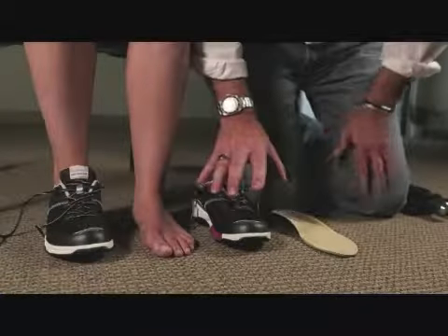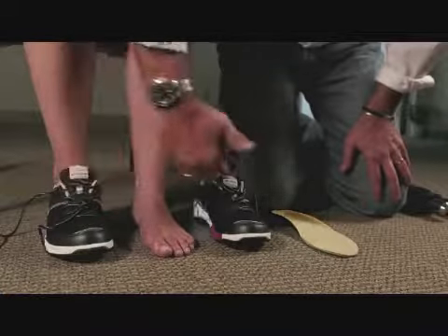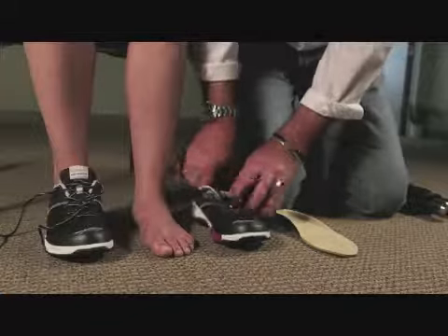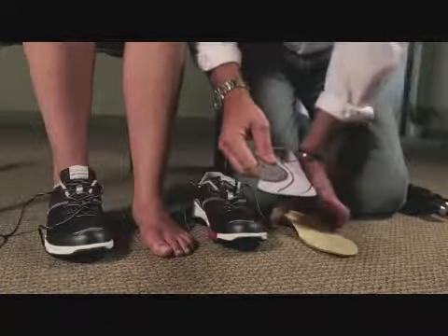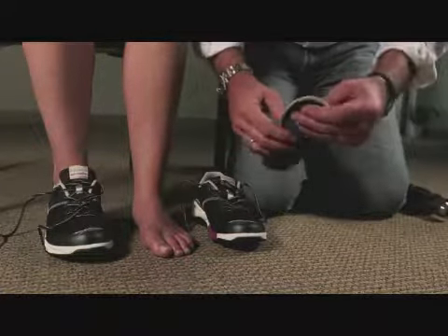To heat mould the orthotic, we're going to heat mould one shoe at a time. We put the other shoe on so that we get a balance for when we're fitting the orthotic. We also then remove whatever insole is within the footwear. We can take that out and actually use that as a template to measure the replacement orthotic.